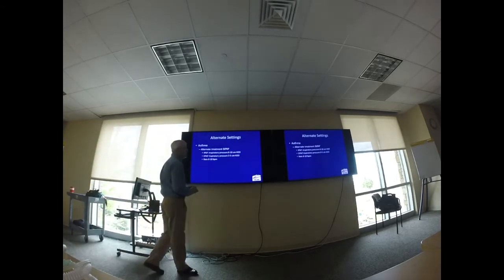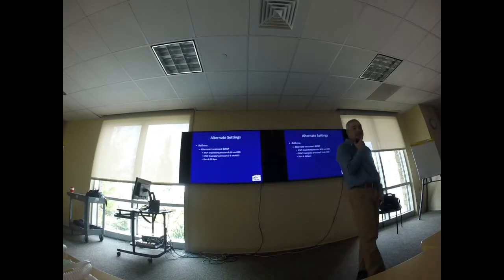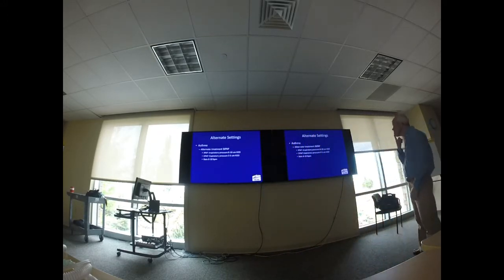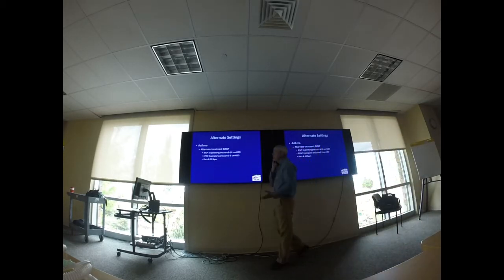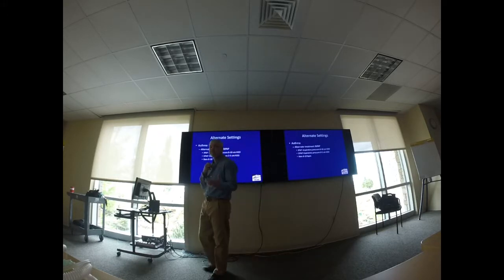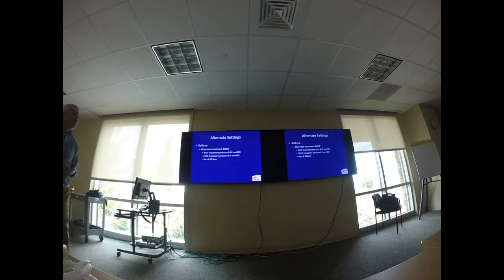Yeah, I mean, I guess in somebody with an obstructive pulmonary disease, it's probably not a bad idea to do. You know, I haven't listened to that one, to be honest with you. So, I mean, intrinsically, we all have PEEP. You and I all have 5 centimeters of PEEP right now. There's some cases where I'd be very worried about giving PEEP, and that's usually like increased intracranial pressure. I haven't heard obstructive, but that makes sense. Yeah, I definitely wouldn't give too much PEEP with those kind of patients because you worry about a tension pneumothorax.